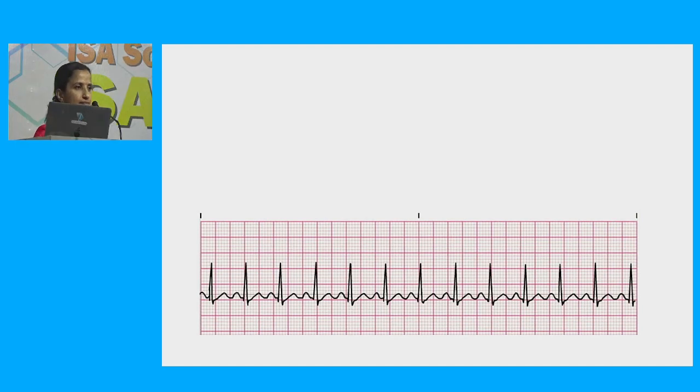Okay. So the diagnosis may be a sinus tachycardia. It is a sinus tachycardia because there are P waves followed by QRS in each, but the rate is more. So what could be the cause? Suppose you see this in your intraoperative period on the monitor. What are the causes? Sinus tachycardia during the intraoperative period, we have to rule out any sympathetic stimulation due to a lighter plane of anesthesia, pain for the patient.